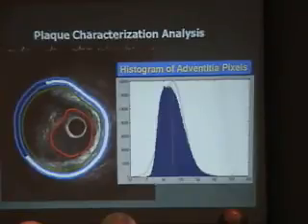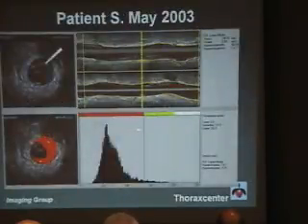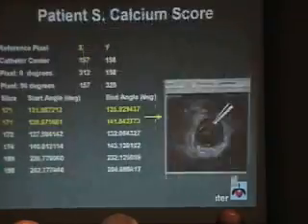Now, in the correlation with the IVUS, which is a novelty, what we do is we take the brightness of the adventitia, we make the Gaussian distribution of this brightness, and the median serves as a reference to define the echogenicity of the lesion itself. In other words, in this plaque, what is on the left-hand side of the median for the brightness of the adventitia is hypoechogenic, what is on the right-hand side is hyperechogenic, and you can identify very easily a small nucleus of calcium. And you can quantify that in volume.